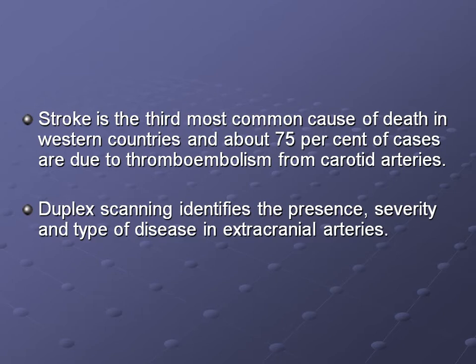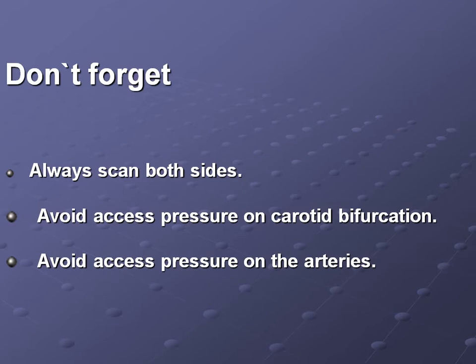Patients with ischemic strokes or transient ischemic attacks, TIA, need their carotid arteries evaluated as a possible cause of the stroke. Duplex scanning is used to identify the presence, the severity, and the type of disease in the extracranial portion of the carotid arteries. Three main points, don't forget them.